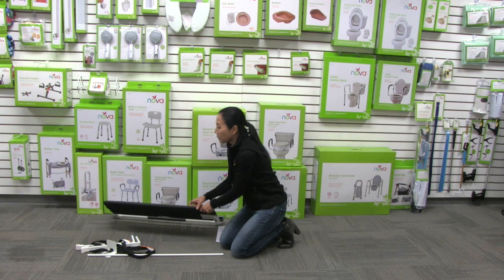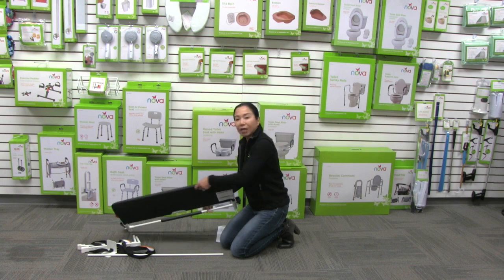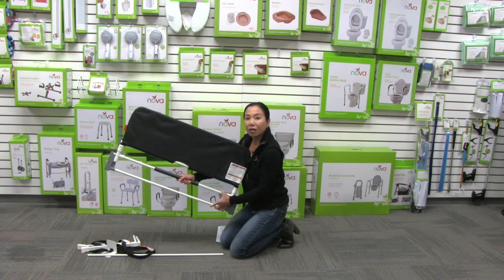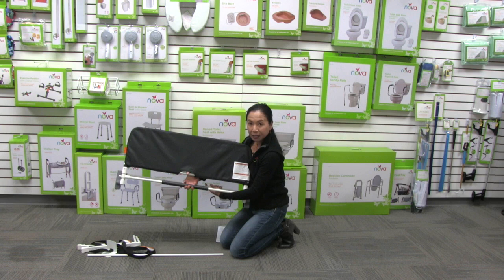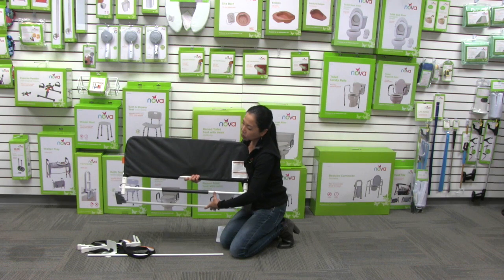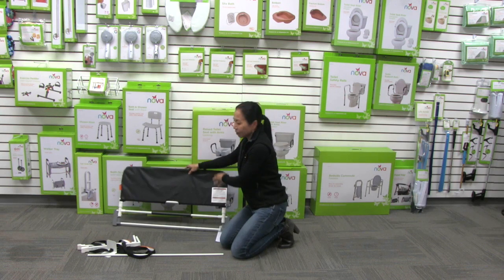The first thing you're going to do is open up the bed rail. You'll see that on this side we have the organizer pouch with the pockets — have that on the outside. You're going to fold down this bar and it's going to lock into place. This is the mechanism that you pull to release and fold down the bed rail, but to assemble it you fold it in and it locks into place. The pockets should be facing the outside.